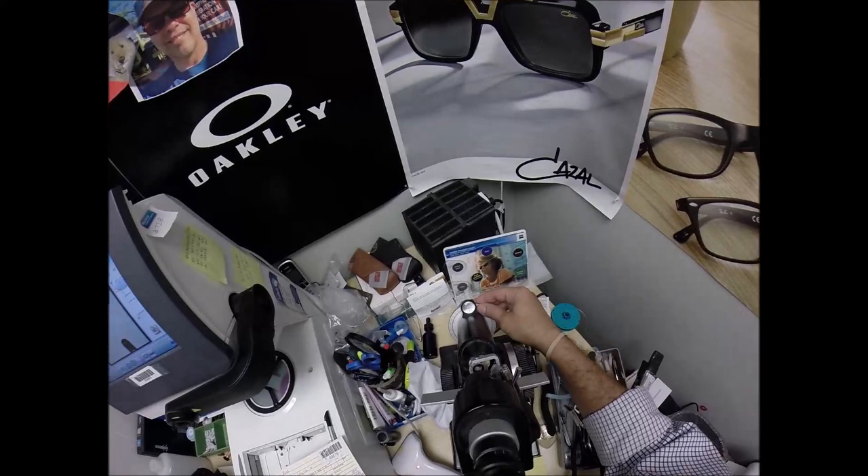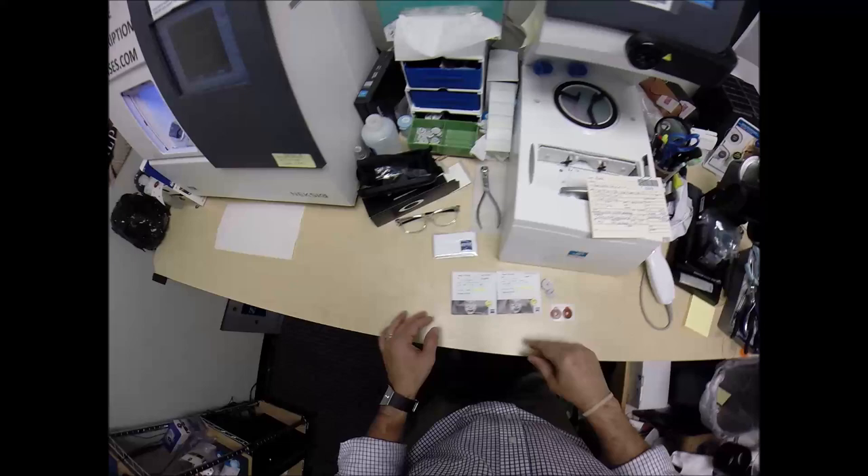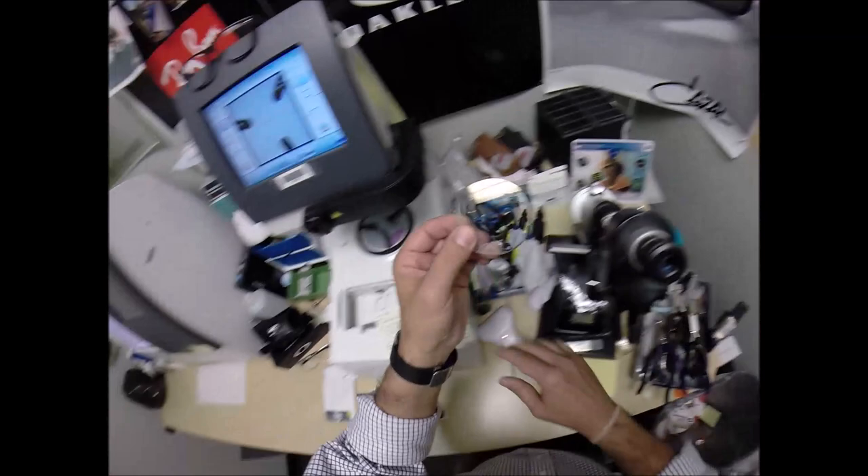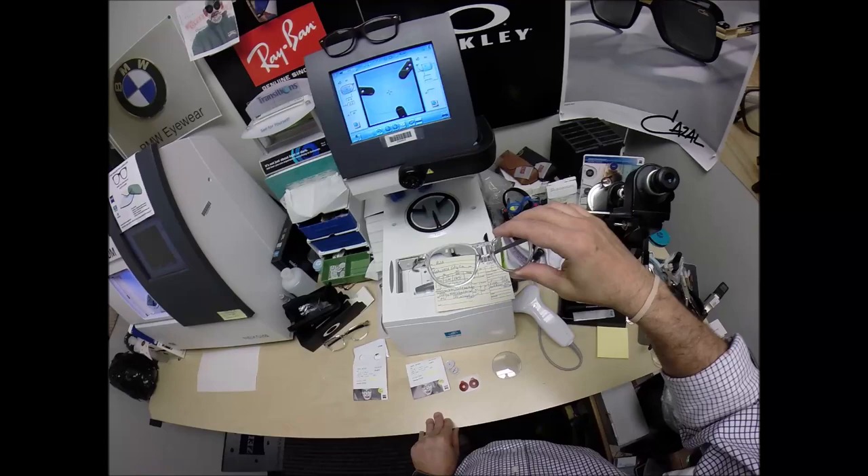Your right eye: minus 275, minus one at 165. I'm going to spin the axis wheel to 165. This has marked the right lens — minus 275, minus one at 165. Let me take everything out so you can see.